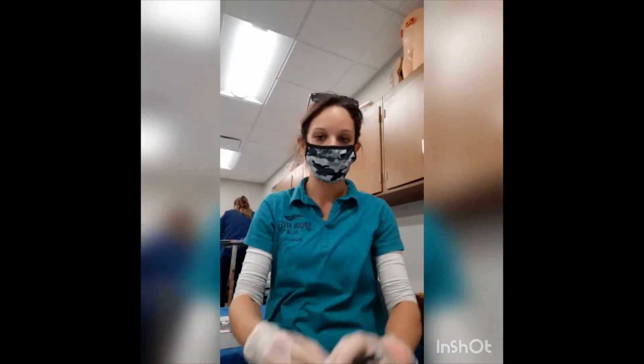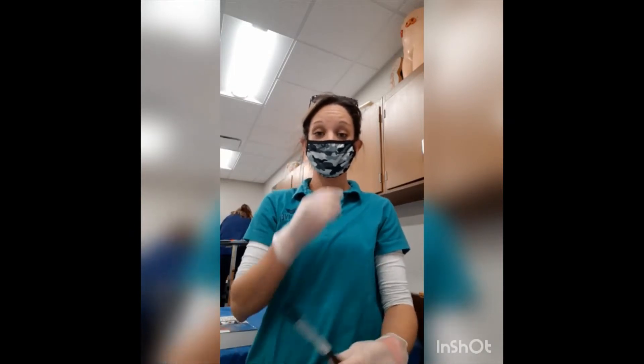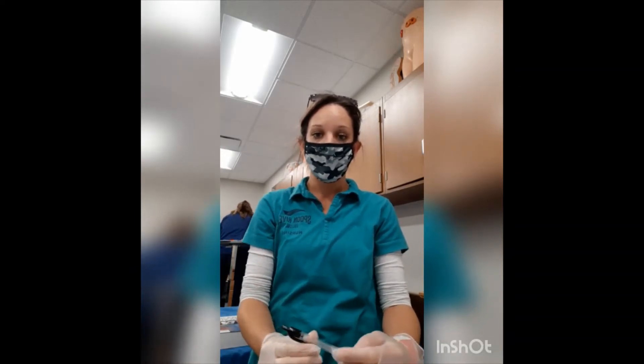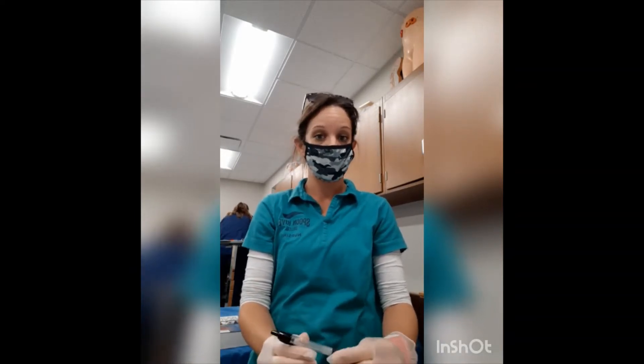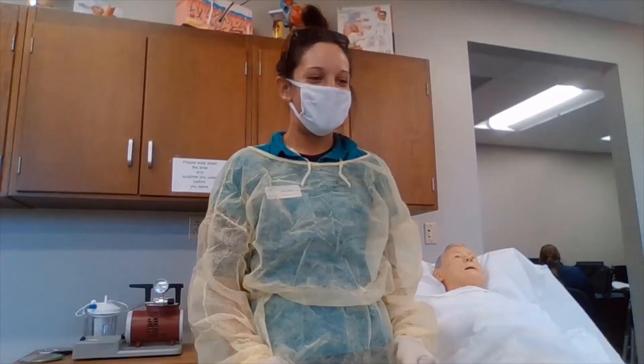We are always going to identify our patient by agency protocol. We are also going to follow state and federal regulations. We are going to abide by standard precautions, make sure that we're wearing gloves, and practice hand hygiene. We are going to ensure patient safety and privacy as well as promote good body mechanics.